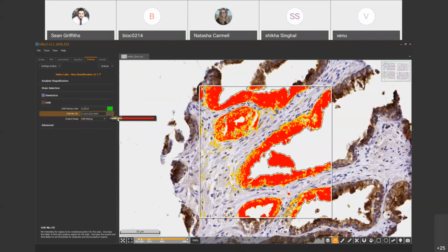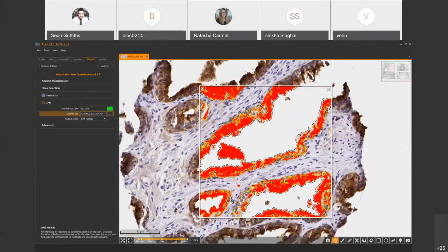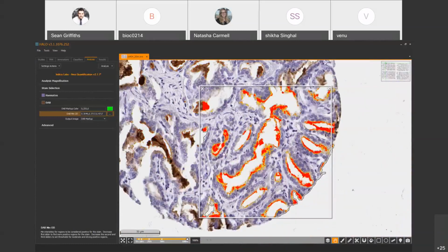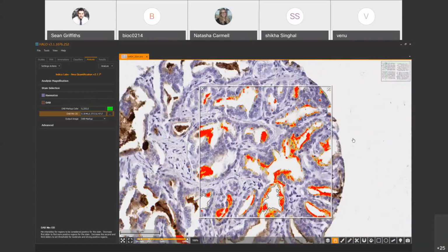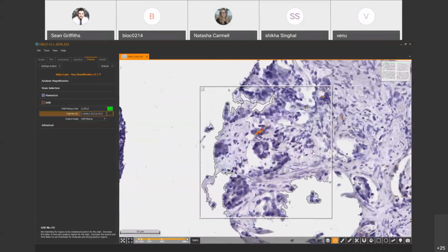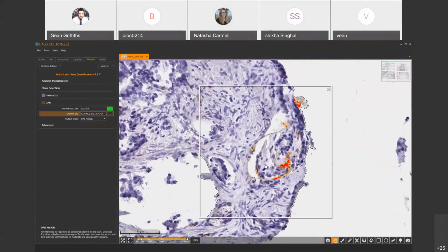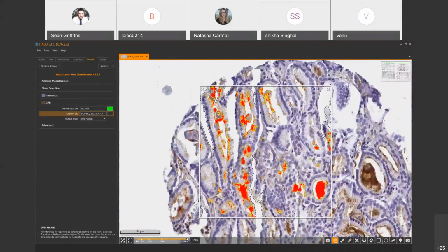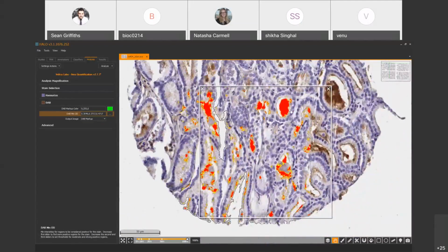A little bit more realistic that you would do it on this large area of staining. Try and make sure you don't have too much background. And this is the time to visit multiple cores because you don't want to optimize just on one core and then have less than perfect segmentation on a core that is much further along. So this is a nice example, actually, some negative cores that we just need to scan over. Here we've got some more moderate staining.